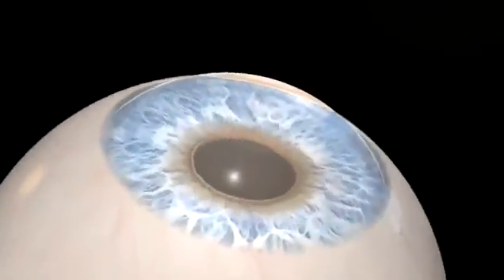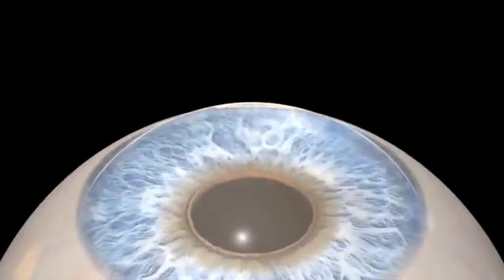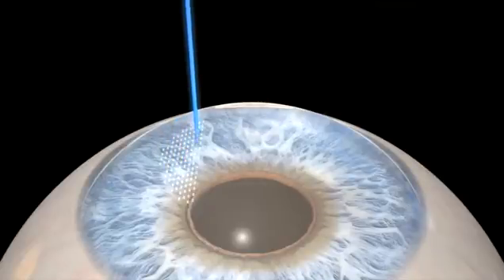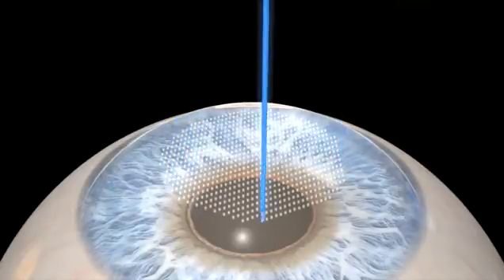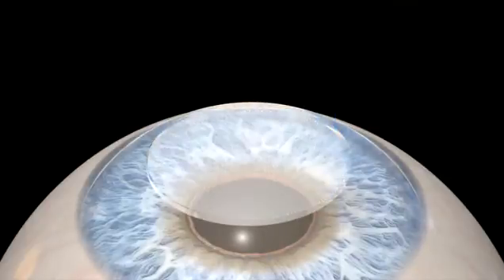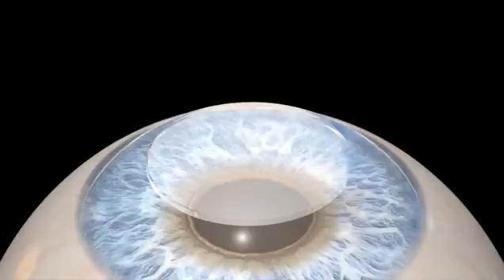Instead of using a bladed microkeratome, we use our femtosecond laser to create a customized corneal flap of the exact thickness, size, orientation, and location without the use of a blade. This level of control makes LASIK safer and allows more patients to qualify for LASIK.